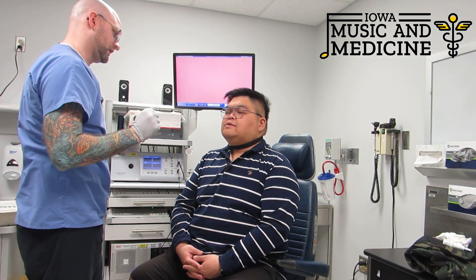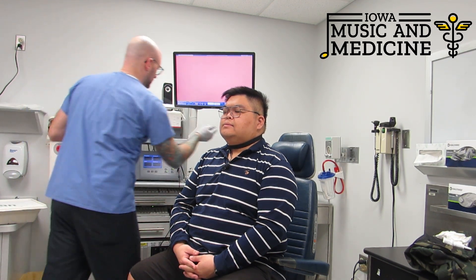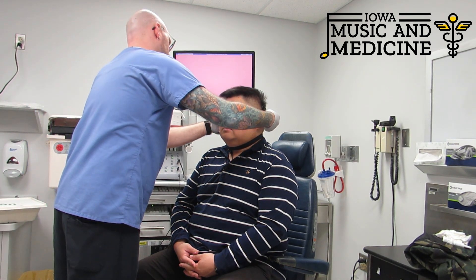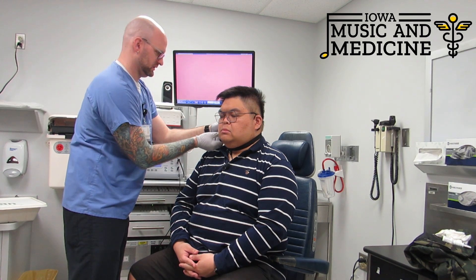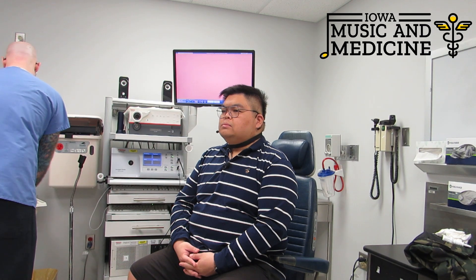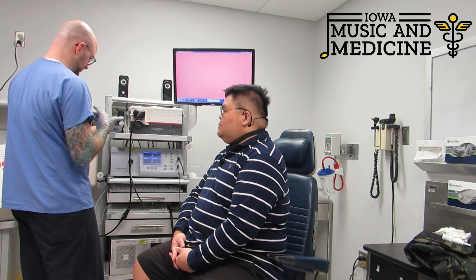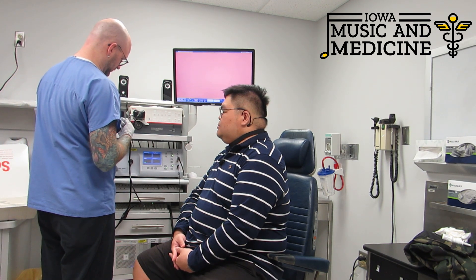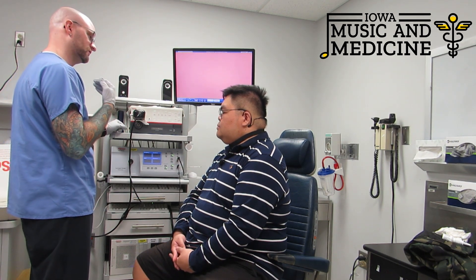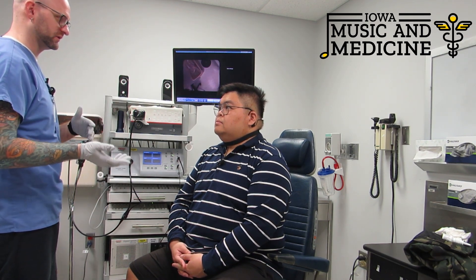That's not too tight on your neck there, is it? Good. Let me just have you say E. This is going to be our primary camera source when we're using the flexible camera, and then this is our stroboscopy machine. So there's a light inside there that will flash according to how fast your vocal folds are vibrating, and it actually offsets the flashing light by one cycle per second.